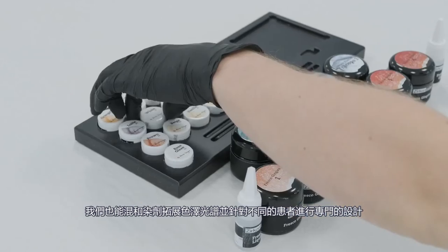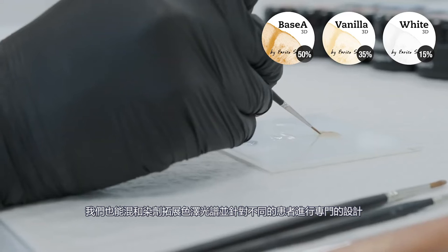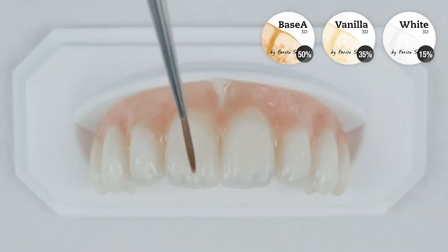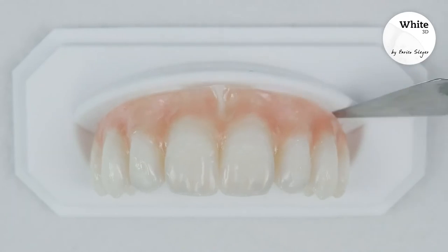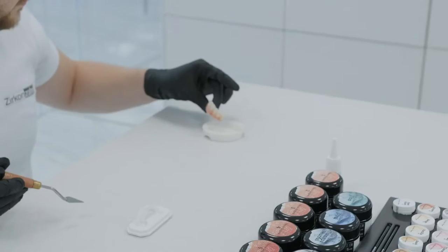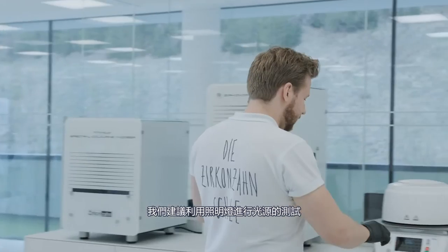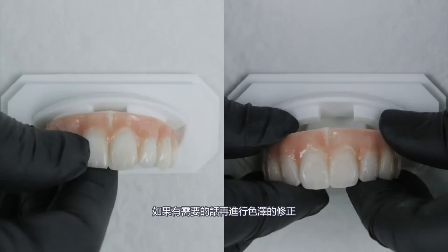By mixing the stains, you can also expand the color spectrum to reproduce a natural tooth shade and create a patient-specific design. To exclude possible pigment accumulations and unnatural effects, we suggest performing a light test — holding the structure against incident light and, if necessary, carrying out a correction.